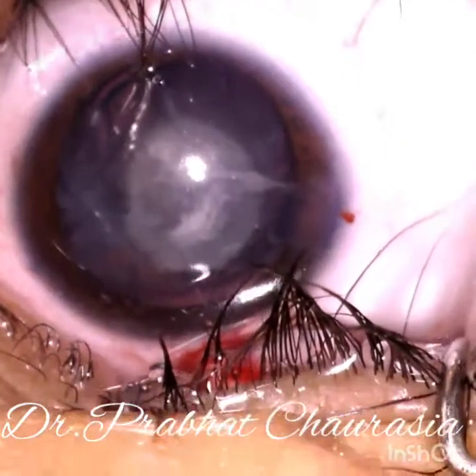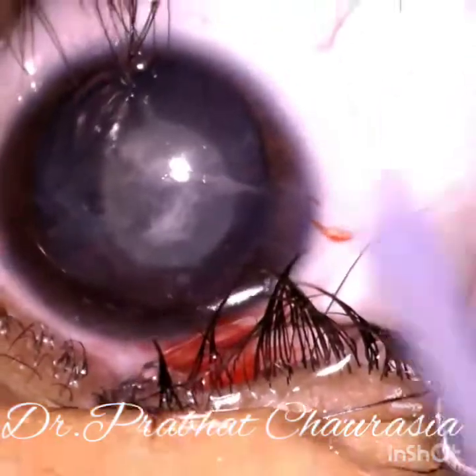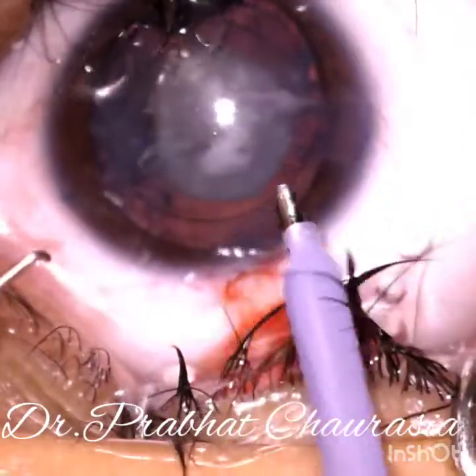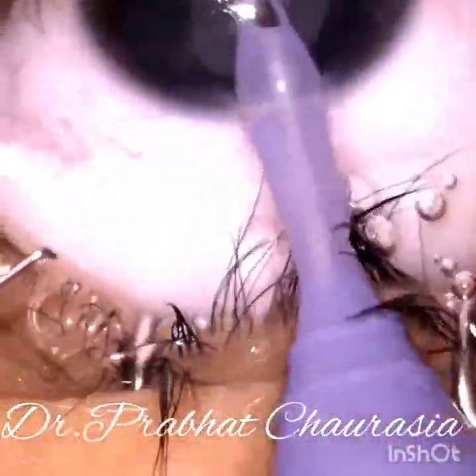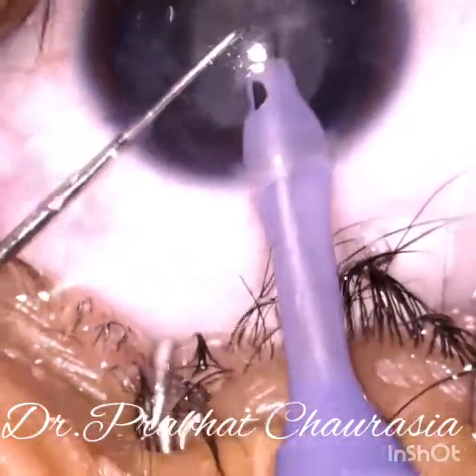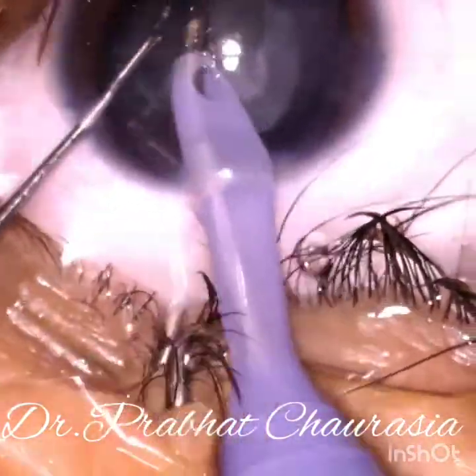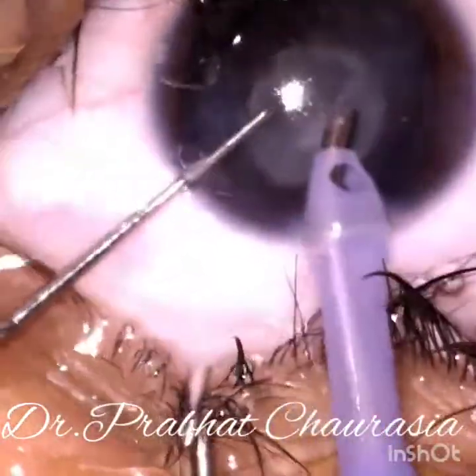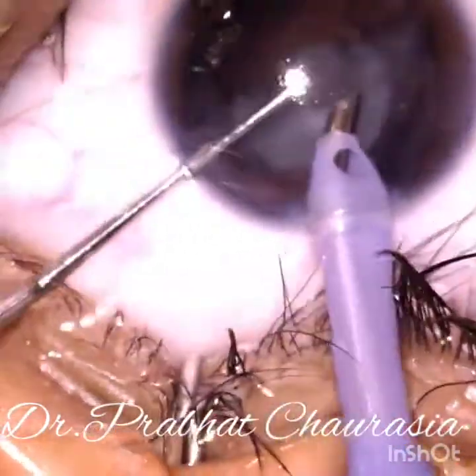Now start emulsification. Introduce the phaco tip and emulsify some superficial cortex without using any power. In such cases you need not use the power.